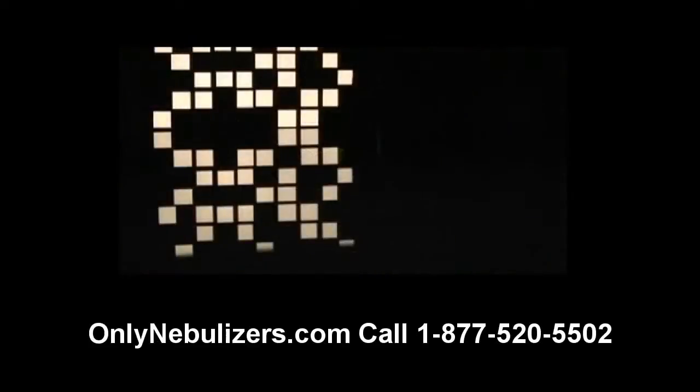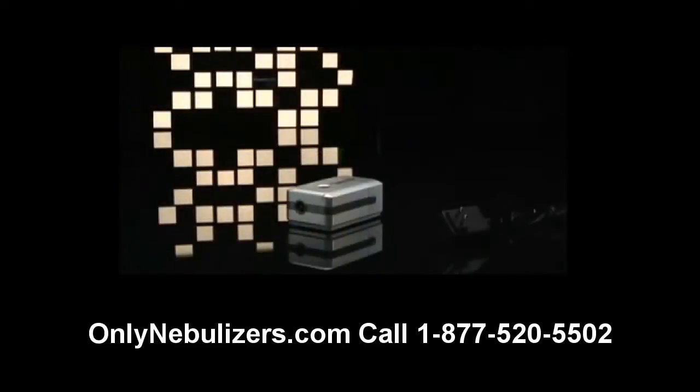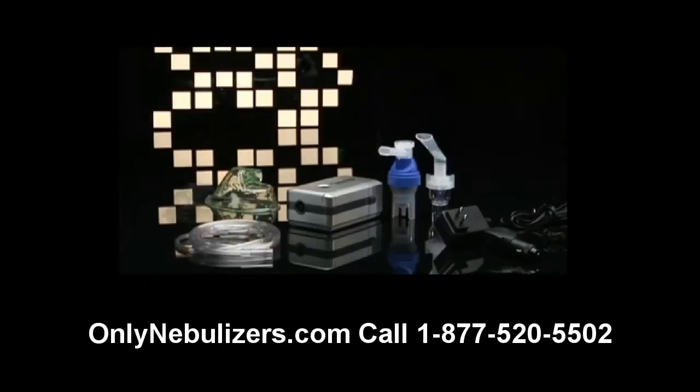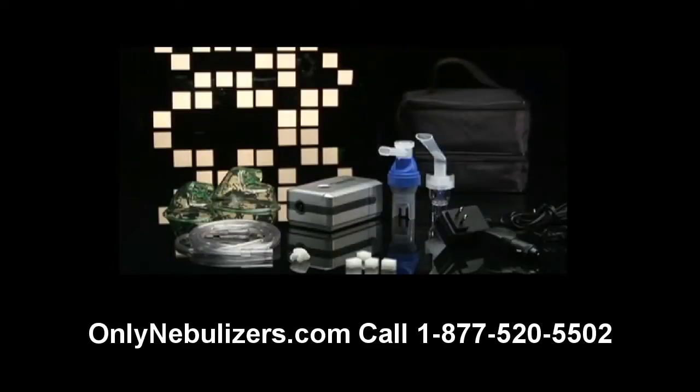The device is very easy to use and includes the following: compressor, AC power adapter, DC power adapter, disposable nebulizer and/or reusable nebulizer with tubing, adult and pediatric aerosol masks, nebulizer holder adapter bracket, replacement filters, carrying case, and battery connection cover.